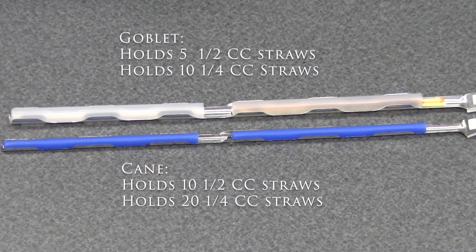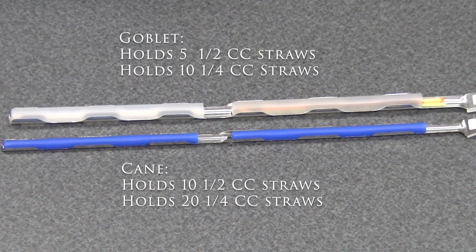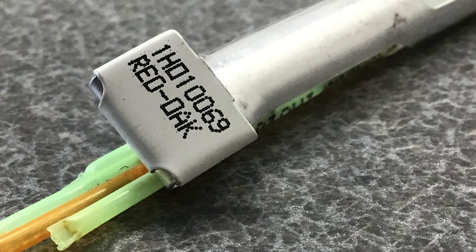Semen is packaged in half or quarter cc straws with five or ten straws per goblet and two goblets per cane. The top of the cane is marked with the cane code to identify the bull and it may also include the bull's common name.